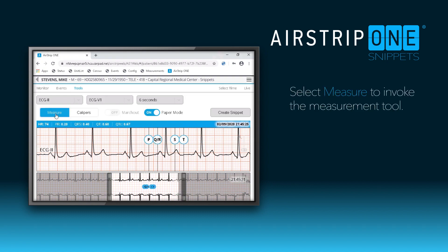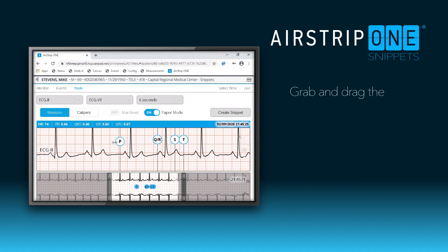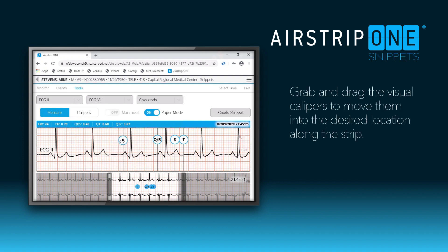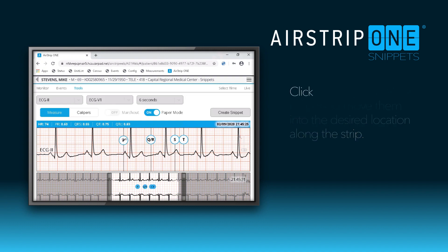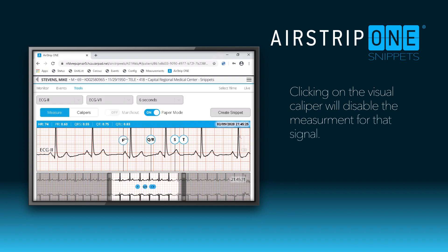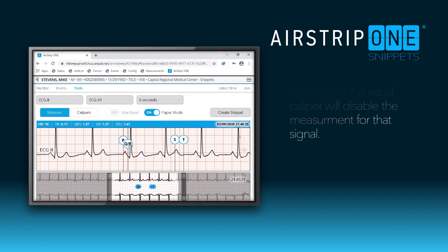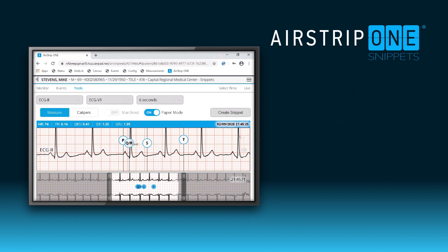Select Measure to reveal the digital calipers. You can move the calipers by dragging them horizontally. If the patient doesn't happen to have a P-wave, you can click the caliper to disable the measurement for that signal. Place all of the calipers in the proper position. You can see the measurements updating as you place the calipers.